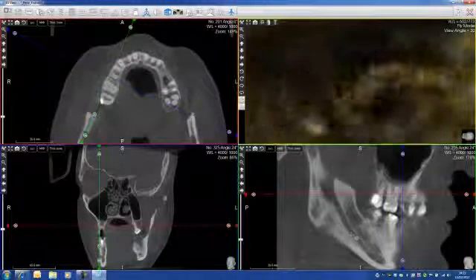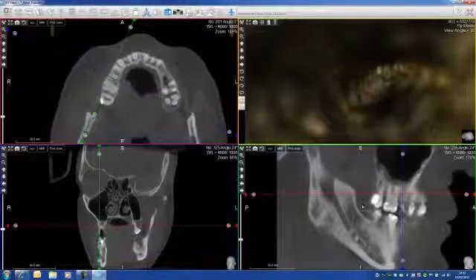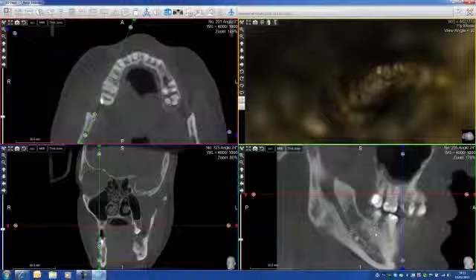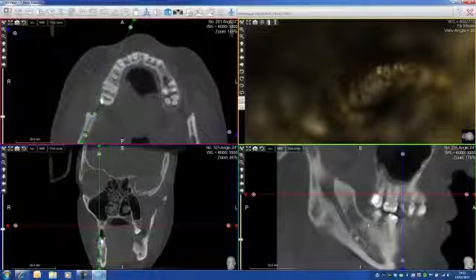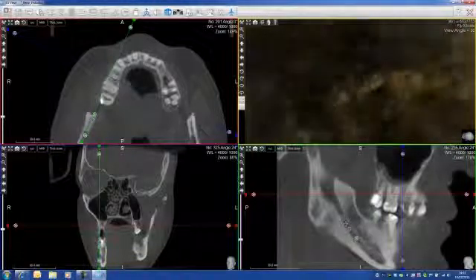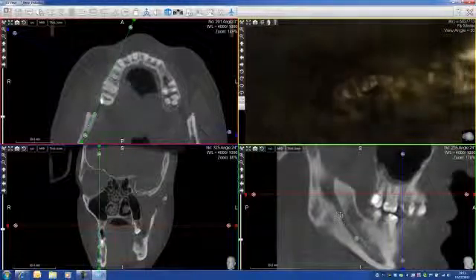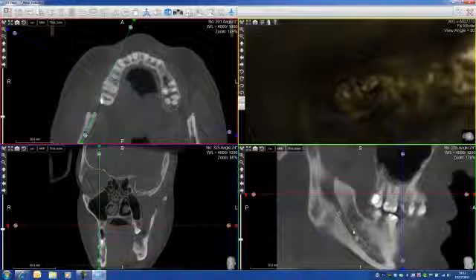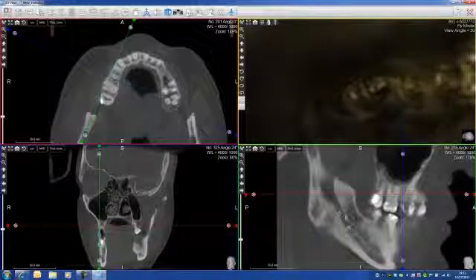Sometimes this will allow you to check if your implant is not too deep inside the mandibular canal. It will also allow you to check how many canals your mandibular canal has.